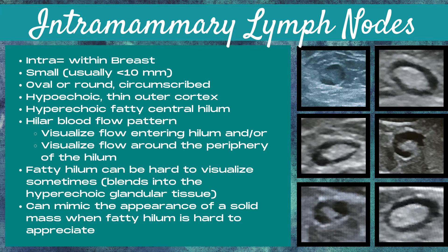The fatty hilum can be hard to visualize sometimes because it blends into the hyperechoic glandular tissue, and so sometimes we can't find intramammary lymph nodes because of this. The fatty hilum blends into the fat and they're obscured on ultrasound. Intramammary lymph nodes can mimic the appearance of a solid mass because sometimes the fatty hilum can be hard to appreciate.